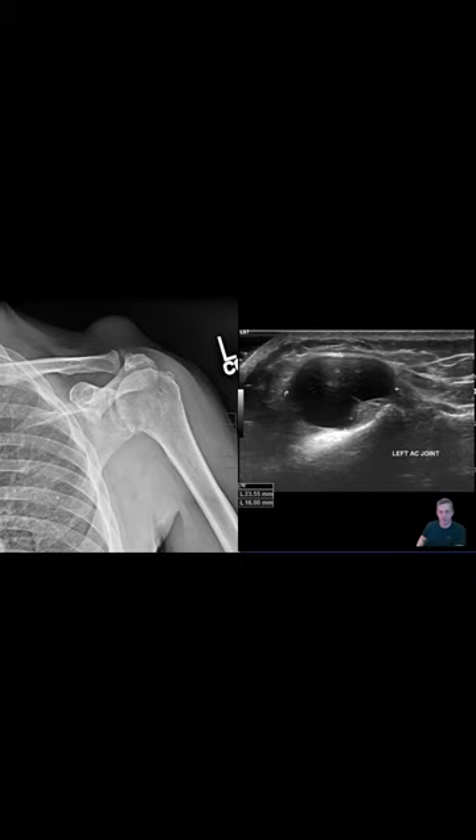On the right side you see an ultrasound — this is actually a different patient but a better view. On the ultrasound, you see a hypoechoic heterogeneous well-circumscribed mass above the left AC joint.